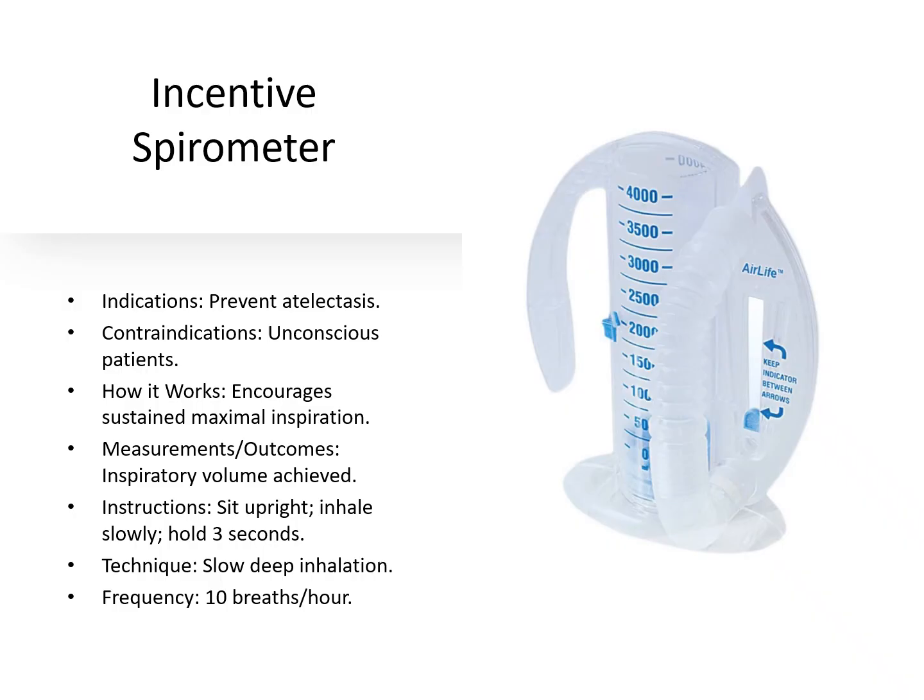Incentive spirometers help prevent atelectasis. They aren't appropriate for unconscious patients. They work by encouraging slow, deep inspirations to reach a volume goal. Outcomes include improved inspiratory volume.